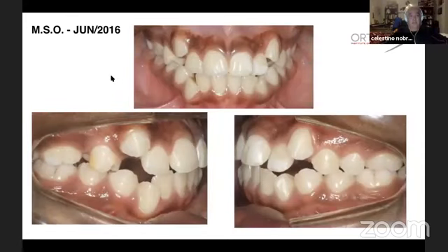Again, this is my question, you know? I would love to treat this patient under aligners. I would love to have all of my patients under aligners. You know why? Because when I treat with aligners, there's not a lot to do manually. You take a lot of time to plan the case in the computer, okay? A lot of time for planning and thinking about the case, but on a daily basis, you don't do many things. When I have a patient under aligners, we can see the patient every 8 weeks or so, with 15-minute appointments.